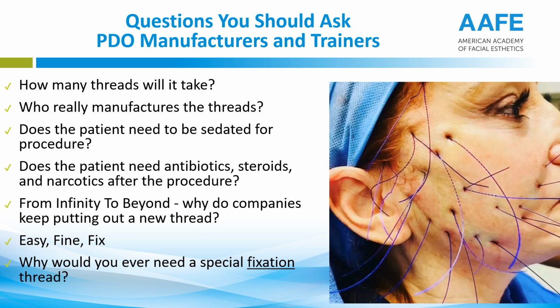What do I want as a clinician for my patients? The maximum effect with a minimum amount of product or threads or Botox or fillers or anything else. That is the philosophy that you all have as healthcare professionals here. So ask them, how many threads is it going to take? Who really manufactures the threads? Because as you're going to see in a moment, we're going to get to the FDA clearance on these threads. Does the patient need to be sedated for a procedure? This kind of procedure that you see right here on this slide, again, it's not AFE, it's not V-soft lift.